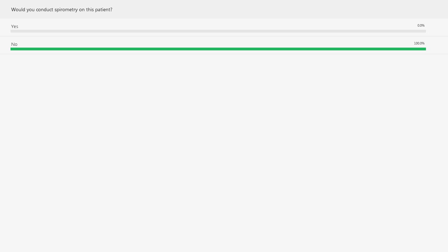Symptom tolerators can sometimes get in a lot of trouble before they report having trouble. This one I'm a little bit more of a fence sitter on. If the clinician knows this patient, and I'm sure his clinician does know him very well, and if he's one of these brittle asthmatics that can fall off the map very quickly, I might want to do a spirometry. Obviously, his ACT is just barely abnormal. Usually we consider 20 as normal. But anyway, there are no absolutely right or wrong answers to this, and there's always more to the story. Thank you. That's a good one.